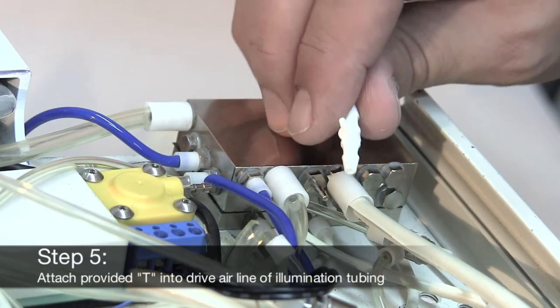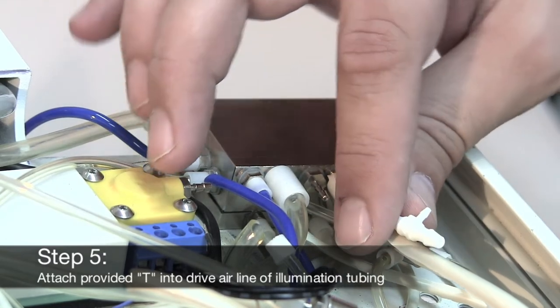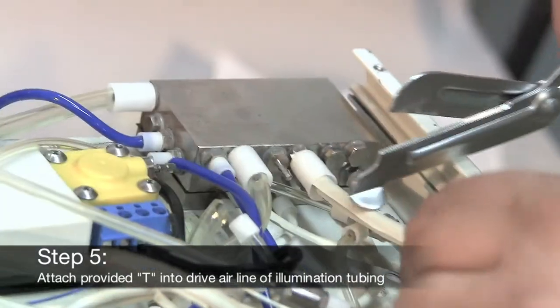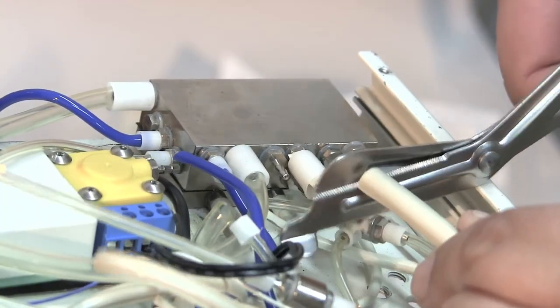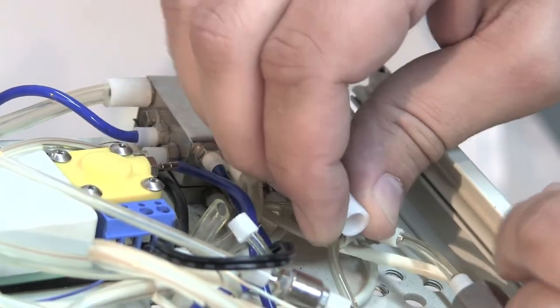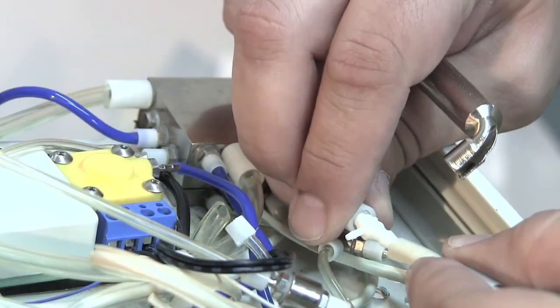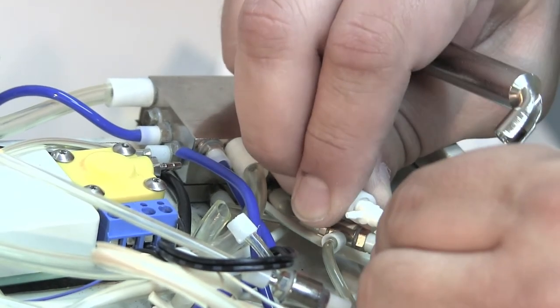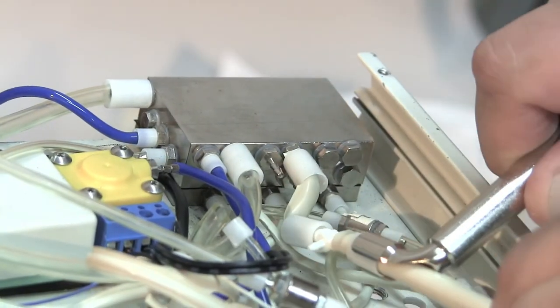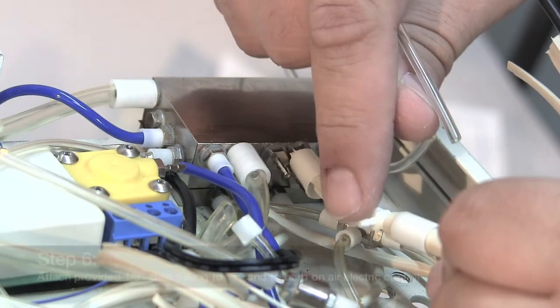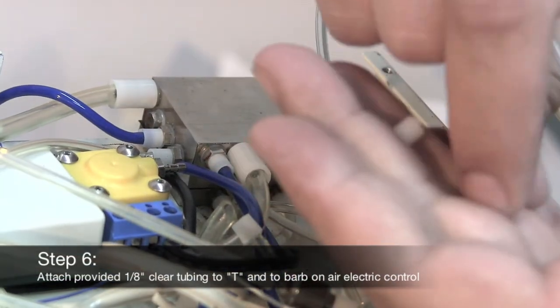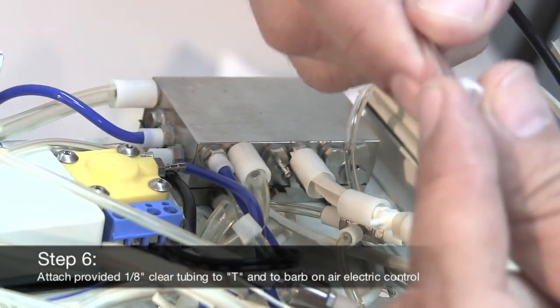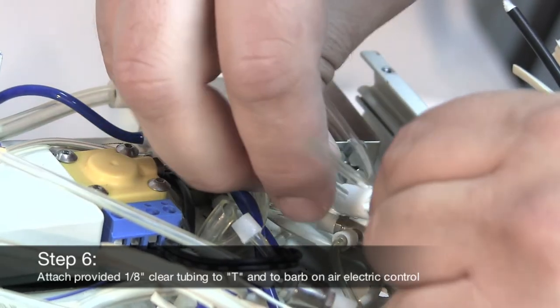Next we're going to splice the provided T into the drive air line of the illumination tubing. Attach one end of the provided eighth inch clear tubing to the T and the other to the barb on the air electric control.